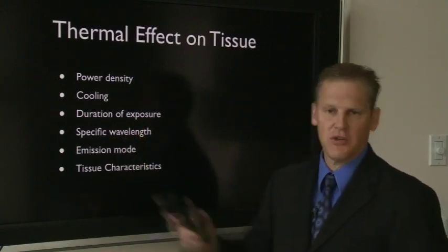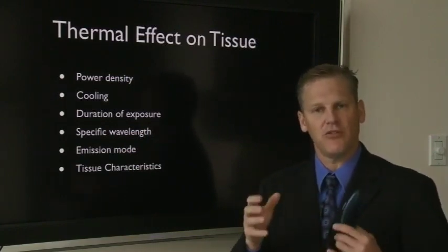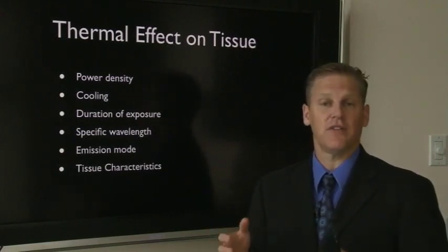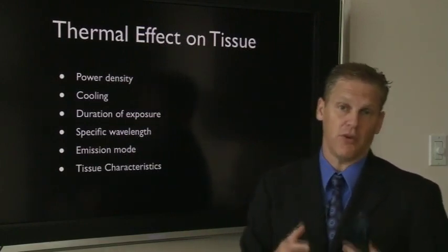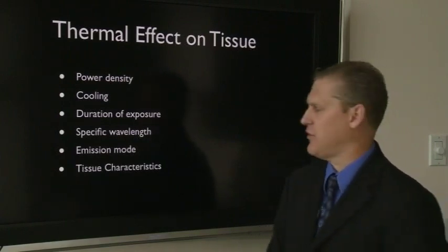You will also find the emission mode, whether it's pulsed or continuous wave. Typically, pulsed lasers give tissue a chance to relax, whereas continuous wave, it's always on. So giving the tissue a chance to relax will again allow it to cool down between subsequent pulses or between the subsequent gated form of the continuous wave.